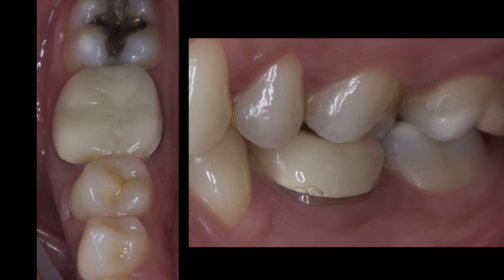This patient presents with an endodontically treated tooth on number 19 that has been restored with a PFM. He stated that he really isn't very pleased with the aesthetics of it, so he requested a more natural restoration. We are going to replace the PFM with a Bruxer crown. It appears some of the veneered feldspathic porcelain has chipped away along the buccal margin, exposing some of the opaque layer beneath.